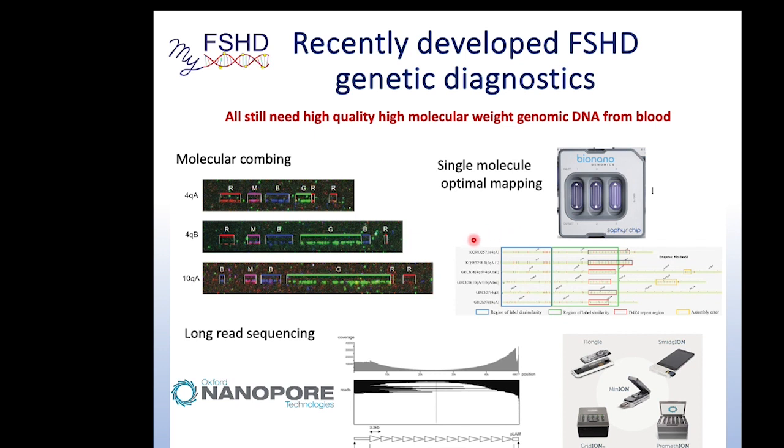The Southern blotting takes a lot of skill. Leiden University Medical Center is probably the best in the world. University of Iowa Diagnostic Lab is really fantastic as well. But I believe they're also switching to BioNano.